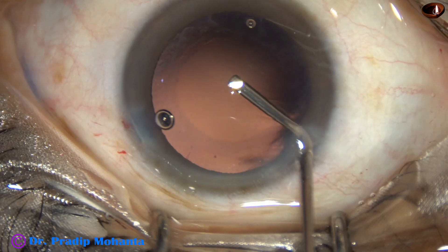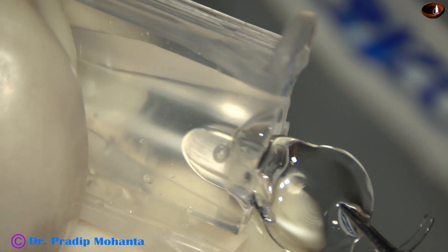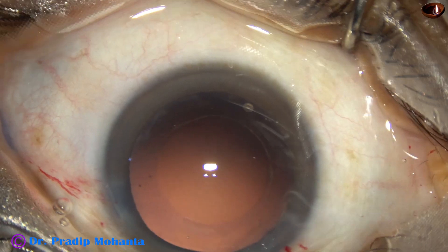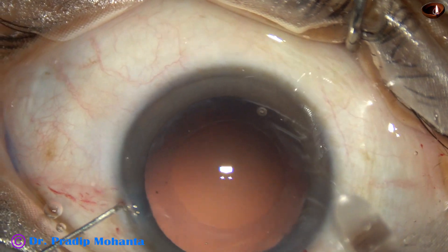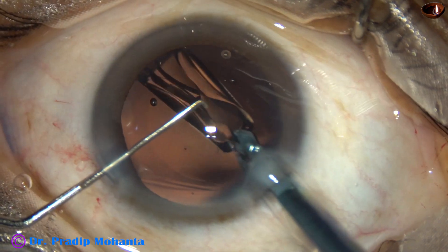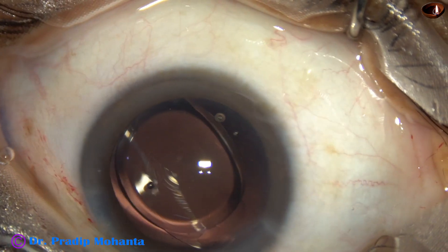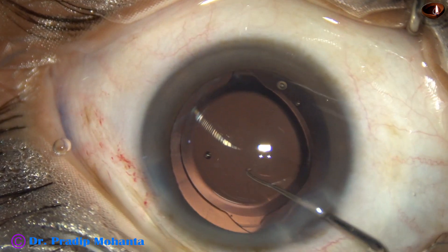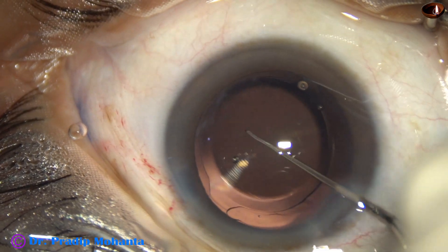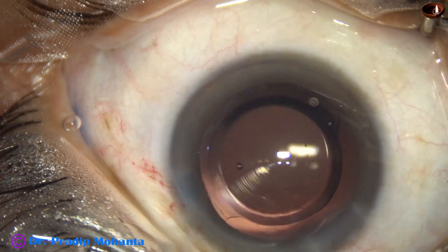Now 2% HPMC again fills up the capsular bag and the anterior chamber. This is the Technis multifocal intraocular lens. This is wound-assisted implantation — the main wound has not been enlarged; same 2.8mm wound — and the lens goes into the capsular bag. The anterior capsular margin is checked and I find that the optic is overlapped by the anterior capsular rim all around.